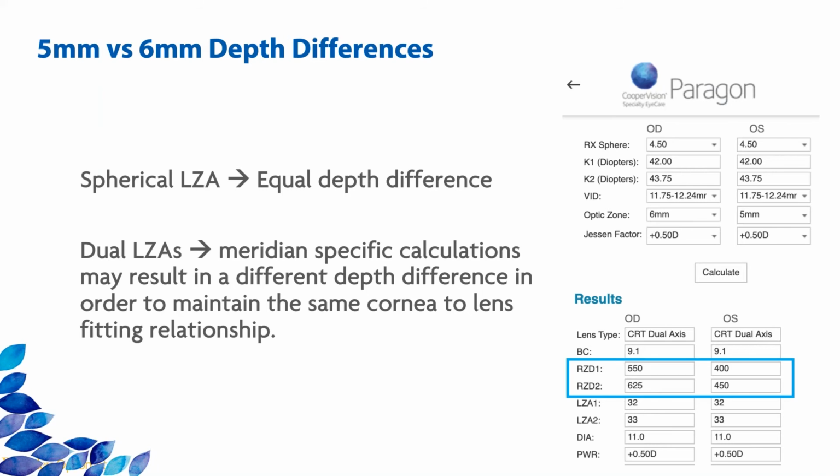Excellent, thank you. And another question was, it seemed that the lens, the 5 millimeter OZD design, had a faster onset of treatment. Was that true also for patients with corneal toricity? Up to how much corneal toricity do you think the 5 millimeter lens design can correct?